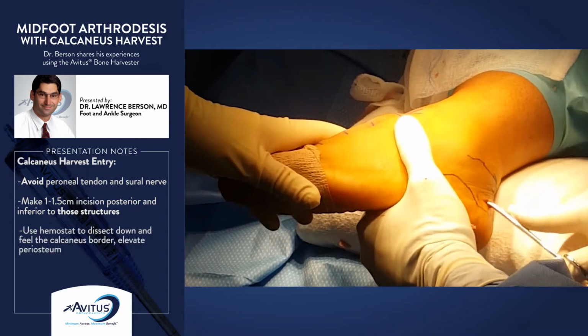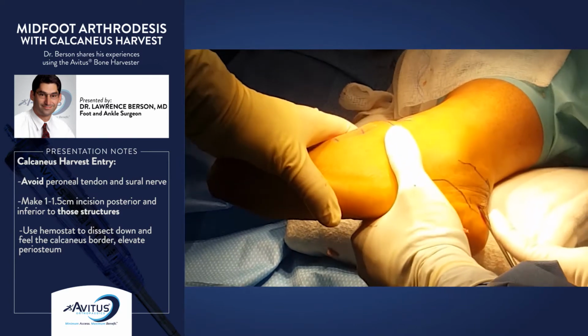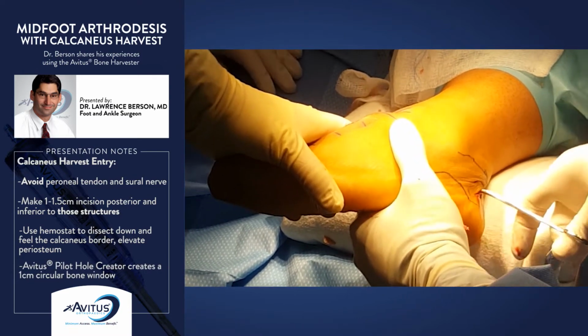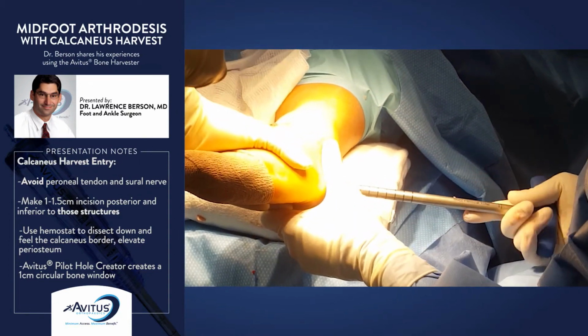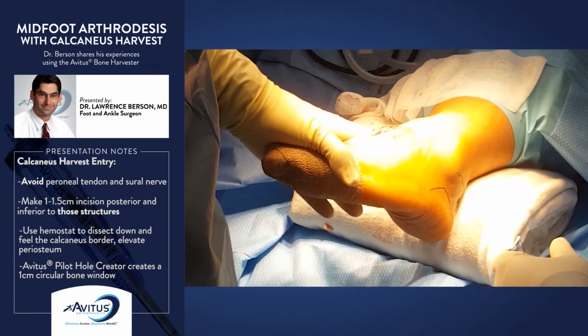Dissecting down with the hemostat and also feeling the calcaneus border with the hemostat to make sure I'm not going inferior or under the calcaneus bone. I have a pretty good idea of where the calcaneus border is now, so I'm making my starting hole. Here we are using the Avitus pilot hole creator. This makes a 1 centimeter bone window.